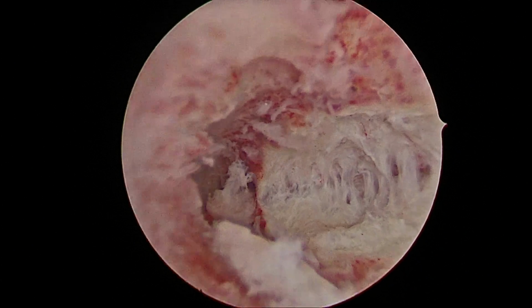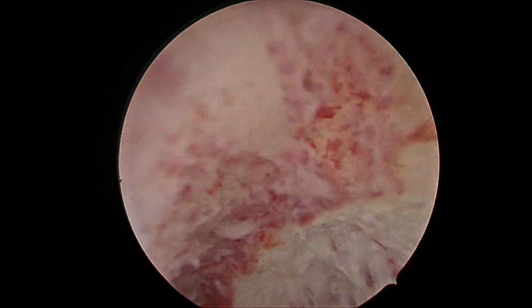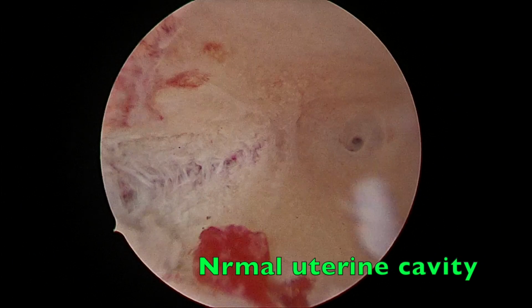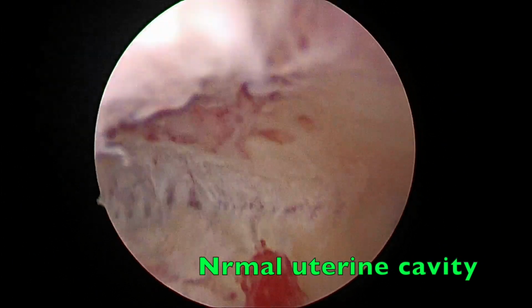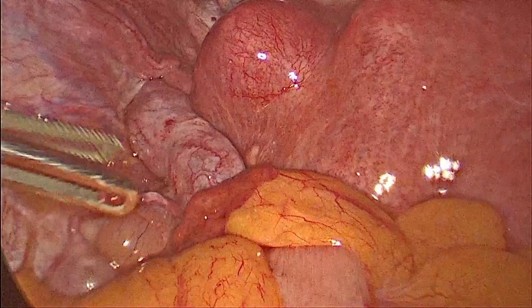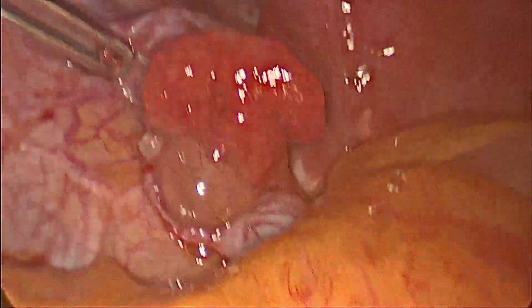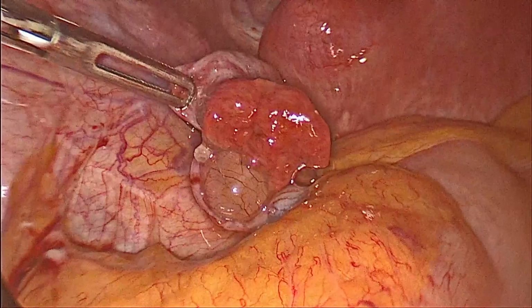So that's the right tubal ostia which can be seen now, as it was obscured in the beginning of the surgery. So this is a view of laparoscopy where the fallopian tube is seen normally.